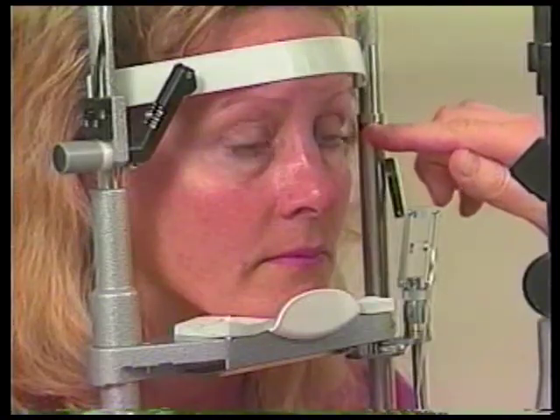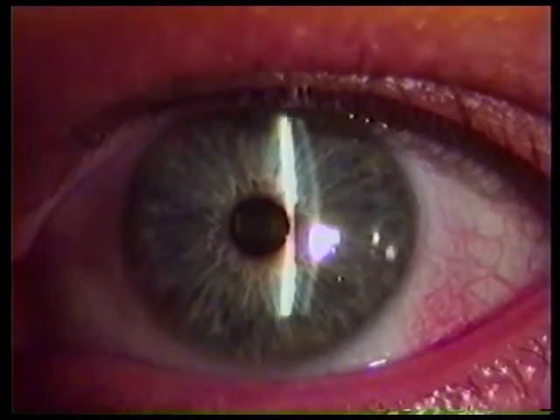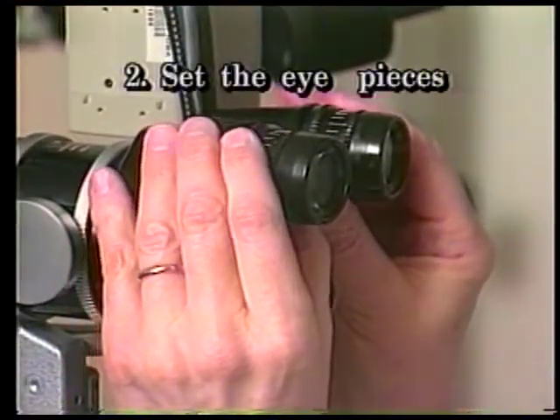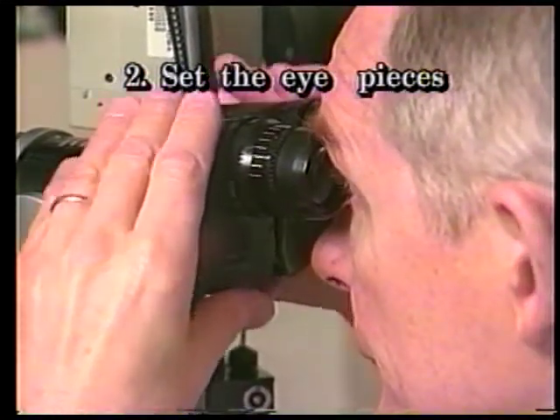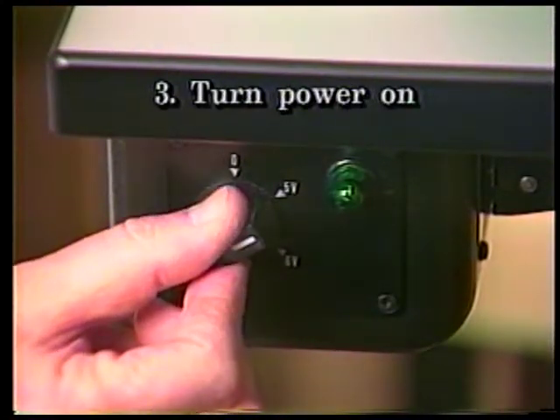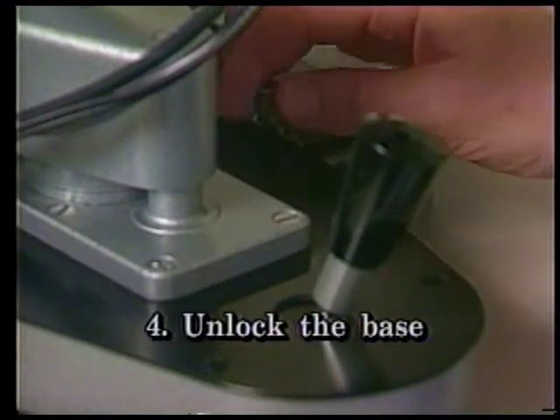The patient's eyes should be level with a black line on the headrest column. This indicates there will be equal vertical maneuvering room above and below this line. Two: set the eyepieces at zero or for your refractive error and adjust the interpupillary distance of the oculars. Three: turn on the power to the slit lamp. Four: release the fixing screw that locks the base or cross slide.